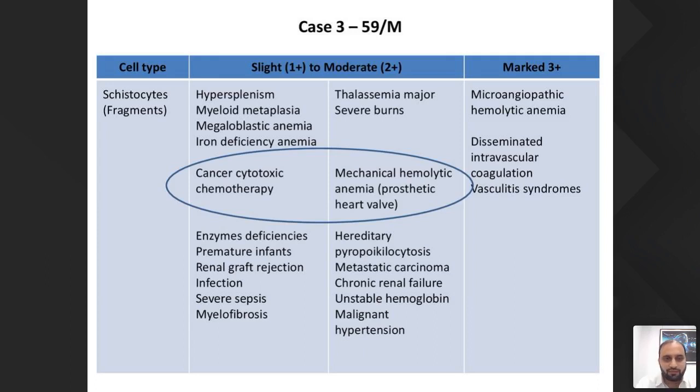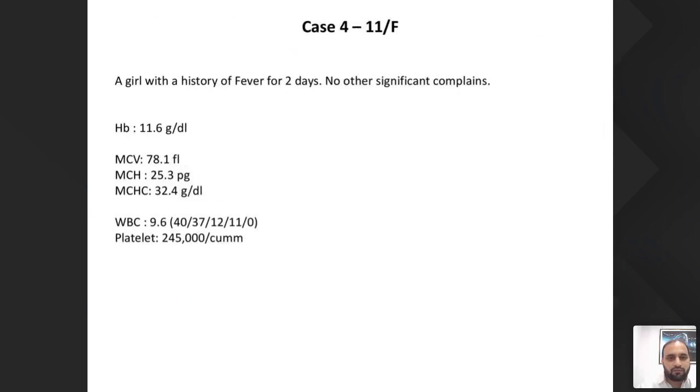Now, why I say rare is because I knew out of 2000 cells it was only 0.5%. So picking such things on manual microscopy, giving relevance to it, might become a bit tough. I don't deny that we were doing it, we were always doing it, but I feel that with this digital platform it becomes much easier, and you have these things kept as archived for any further reference also. I will shift to the next case.